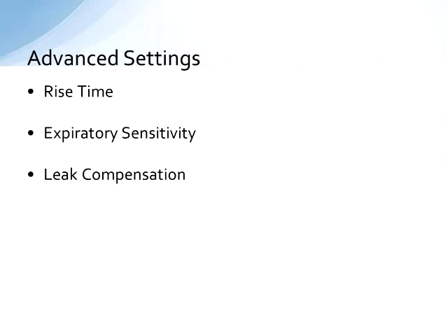If you see a kiddo really working to exhale or having difficulty ending a breath, then you need to evaluate where your expiratory sensitivity is set, and that may need to be more sensitive than where you have it currently to, again, ensure patient comfort. On the flip side, if you have it set too sensitively, you'll end up compromising the patient's delivered tidal volume. So you want to be cognizant of that and find, again, that balance that makes it easy for them to exhale but still allows them to reach the tidal volume that you're shooting for.